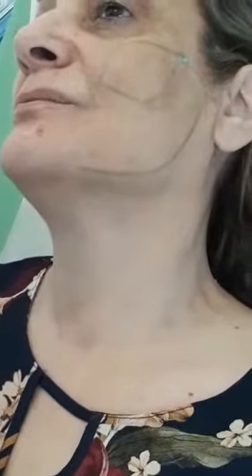It is impossible. I'm not saying it's a natural result, it is impossible. This movement is for the neck. But when you're working on the face, the movement is this one. Is everything clear for you?